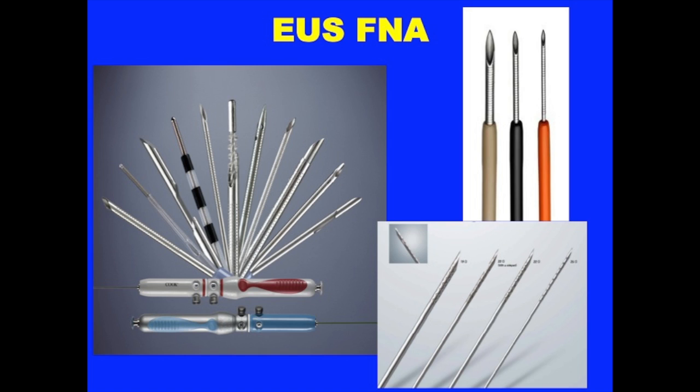We also have tried changing our needles. We have a very broad array of needles that we can choose from now. When I started, there was one needle, and it usually broke at some point during the procedure to where you had to pull it out with needle nose forceps. So we've come a long way in the use of our needles.